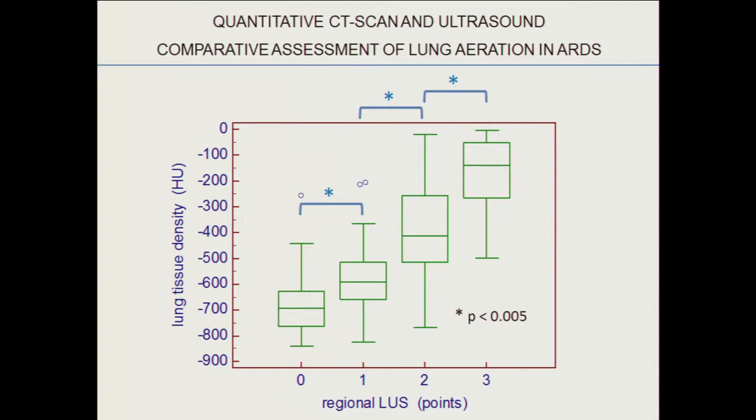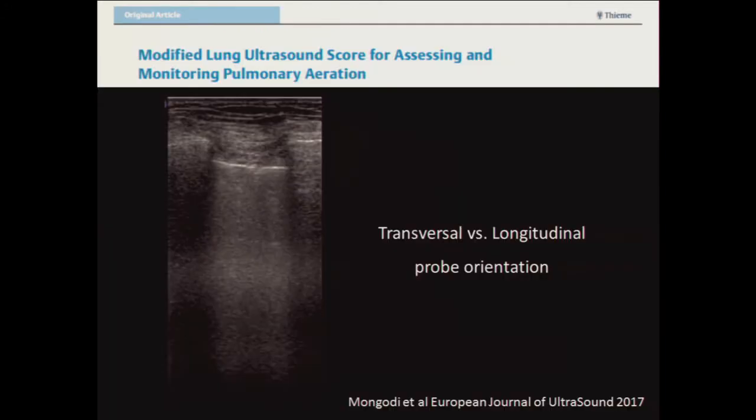So we tried to improve further this scoring system, and we now suggest this modified lung ultrasound scoring system.